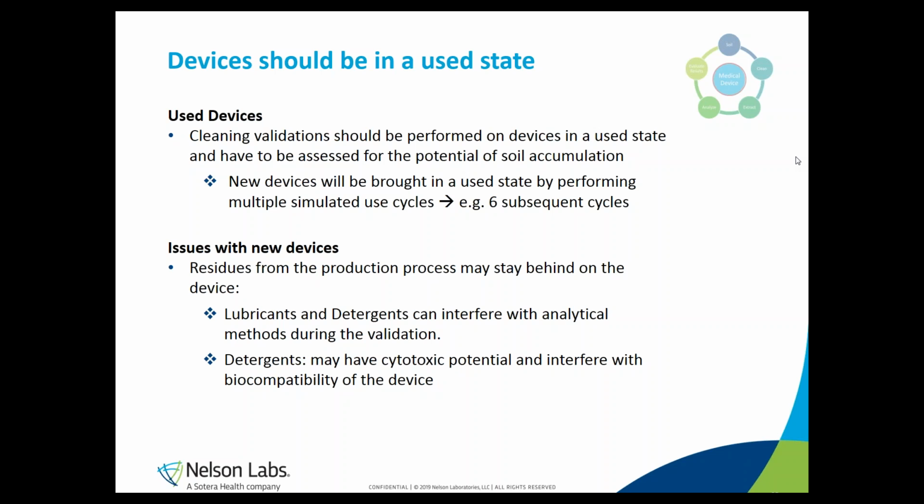properties of the device. Also, any potential of soil that accumulates on the device will be assessed by performing simulated use testing. Therefore, Nelson Labs will always bring your devices in a used state prior to starting a processing validation study in case we receive devices that are not in a used state yet.